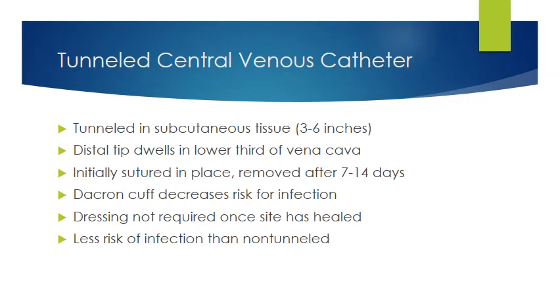Alright, so this slide just tells you what I just said. The tunnel is put in the subcutaneous tissue, and then initially it's sutured in place. It's removed after 7 to 14 days, and that Dacron cuff is what decreases your risk for infection. You do not have to have a dressing on it once the site has healed. Again, this has less risk of infection than a non-tunneled, and that's due to that Dacron cuff placed in the subcutaneous tissue there.